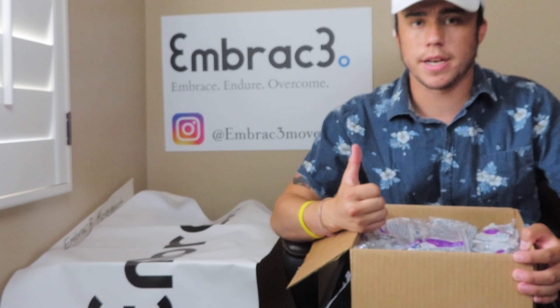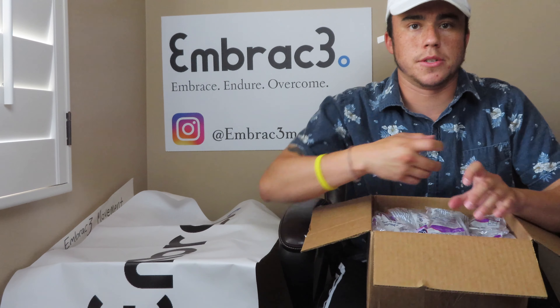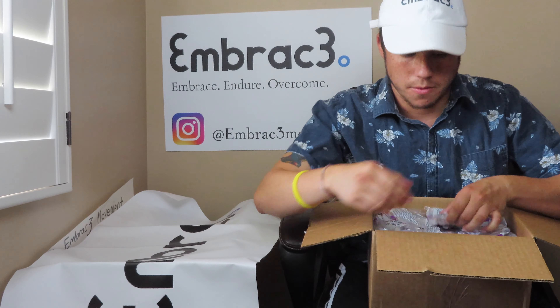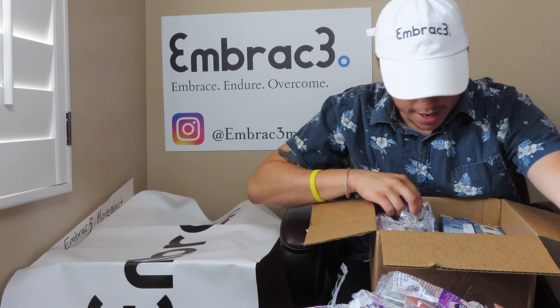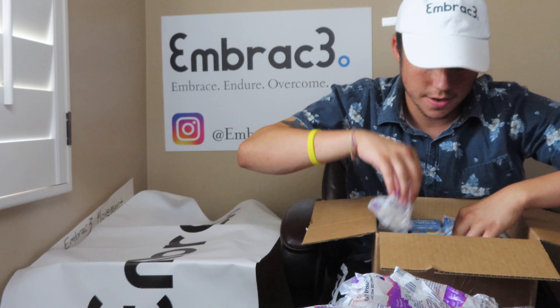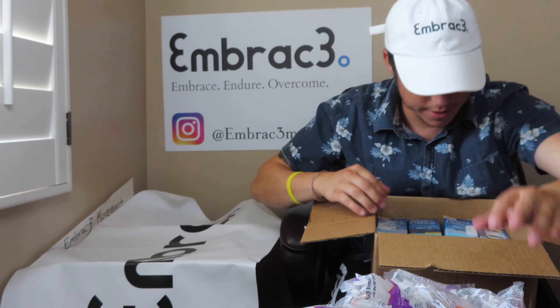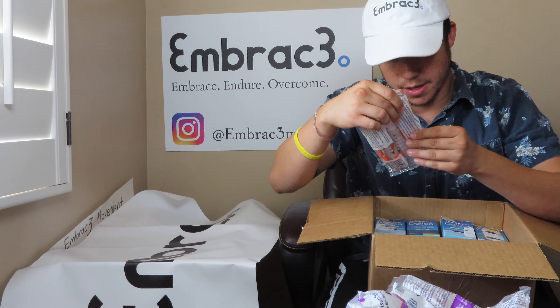We get a lot of pen needles but not enough insulin syringes for the people who are still on syringes, drawing from vials. That is very awesome. We have 1, 2, 3, 4, 5, 6, 7, 8, 9, 10, 11, 12, 13, 14, 15, 16, 17 — 17 insulin syringe packages with about 10 each, so that's 170 needles.